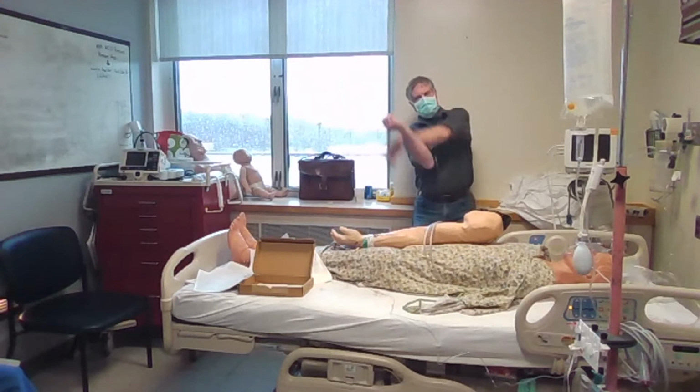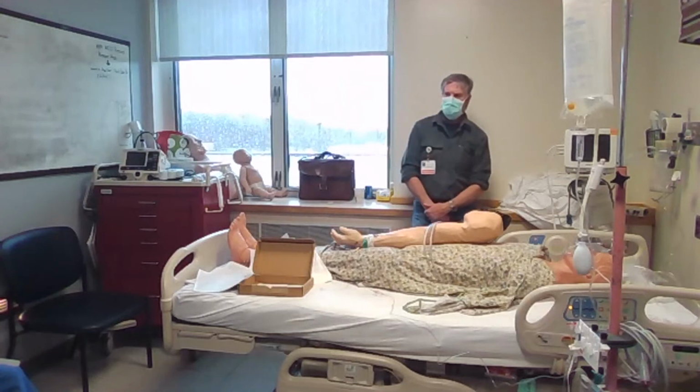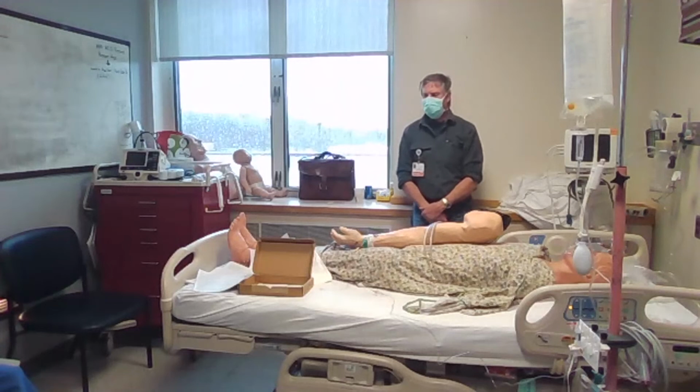You don't have to take the thumb and whack it around, just enough pressure to get it out of the way. Pretty rigid. And then essentially, if you didn't have that, you could just use a regular 20 gauge IV, a 20 gauge angio, and put it in the artery.